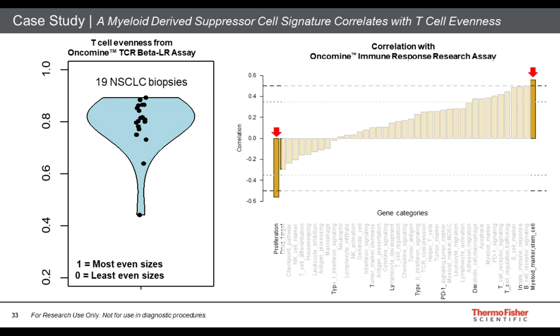One of the primary uses of the short read assay is to be able to use short amplicons, which enables it to be used with FFPE samples, which are by far the most common type of sample available for clinical oncology work. And the downside of working with FFPE samples is that the DNA and RNA are typically very degraded, and so our amplicon-based approach needs to use short amplicons to be compatible with that. The long amplicons would not work.